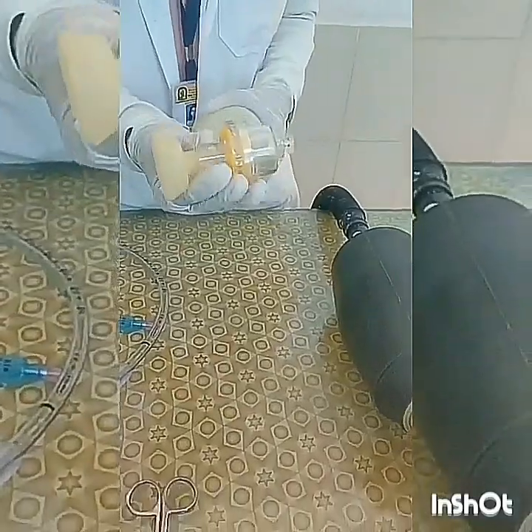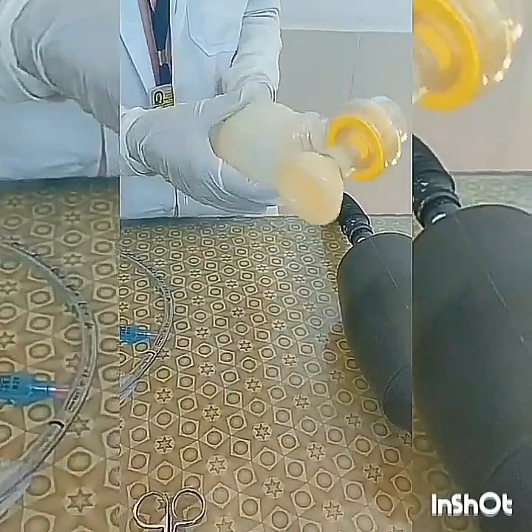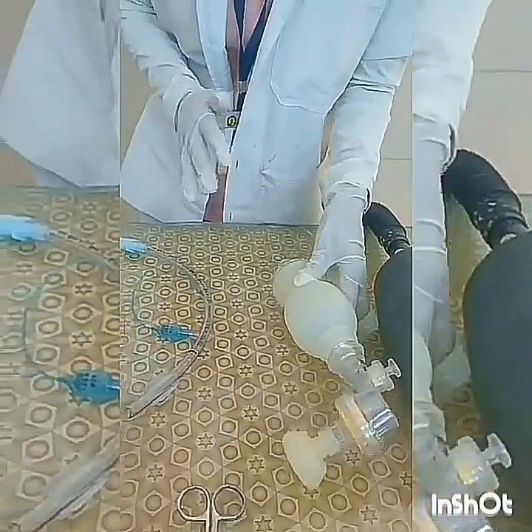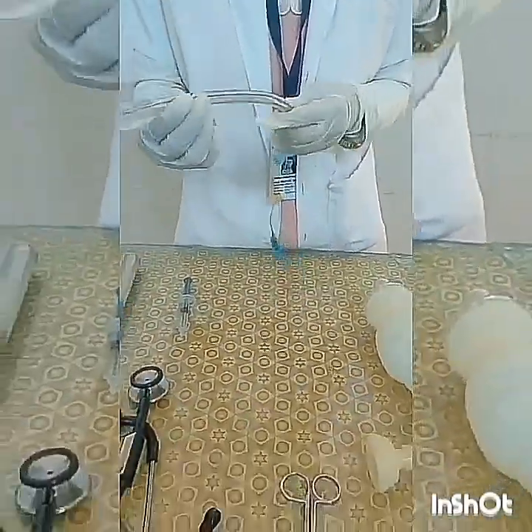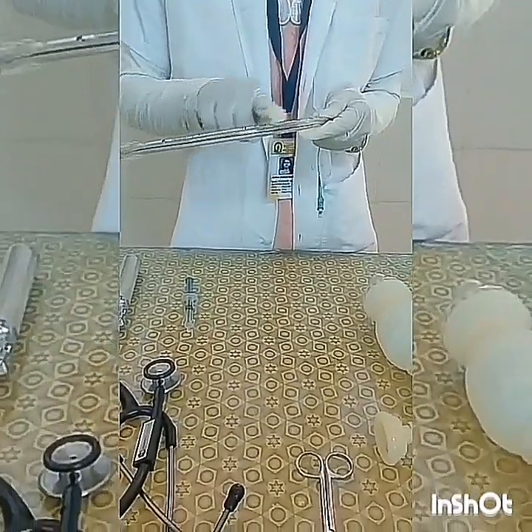This is the outlet. The bag is self-inflating, that is, once squeezed it will inflate back on its own. This is the inlet. Then the endotracheal tube. It has a small opening at the tip called the bevel, that is the patient end. It is on the left side because most people are right-handed, so that the left-facing bevel easily intubates.